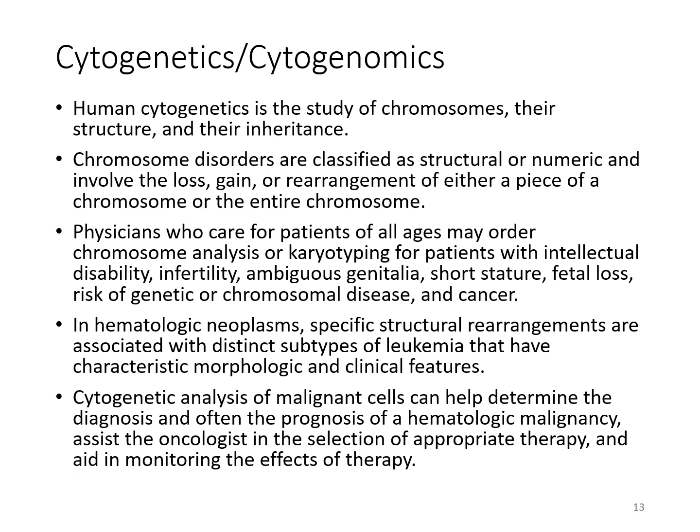Some of the applications that you may be familiar with, and that we've already discussed in other courses or will continue to discuss, include the FISH methodology, which is a molecular cytogenetic technique that uses DNA or RNA probes and fluorescent microscopy to identify individual chromosomes and targeted chromosomal loci.